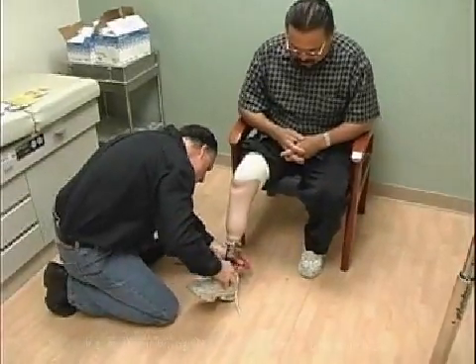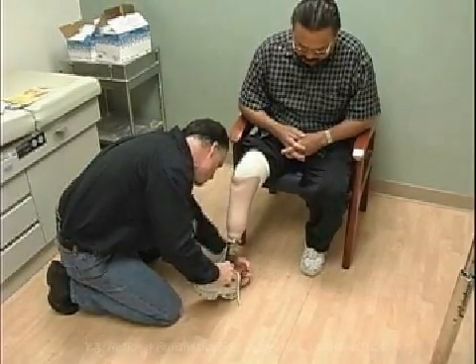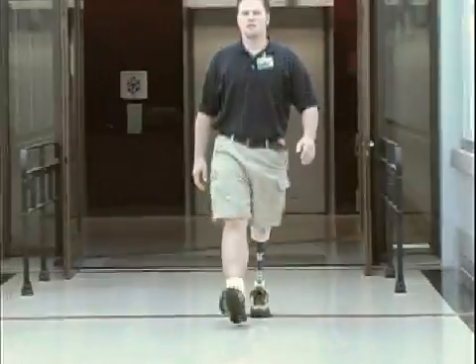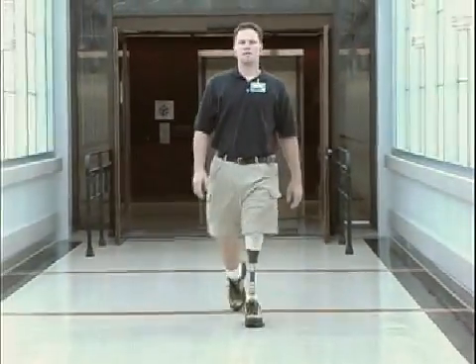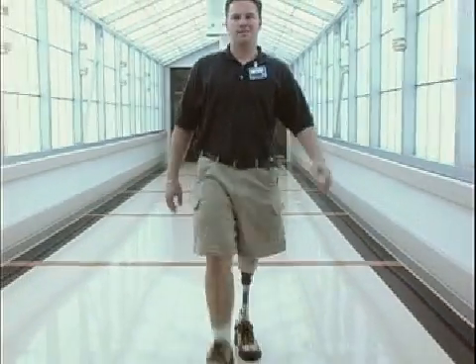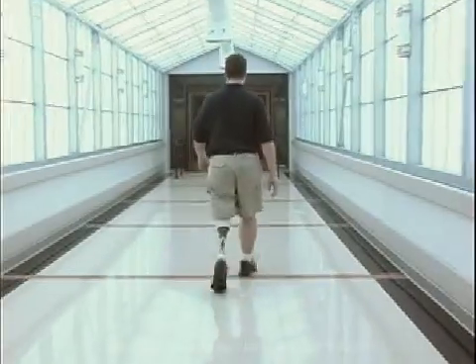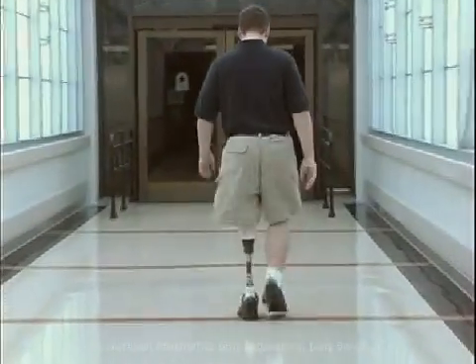The historical conception of a vertical pylon at mid-stance is no longer necessarily valid. If the individual is being aligned or assessed with an adjustable endoskeletal limb, as most persons with an amputation are, the verticality or angular position of the pylon at mid-stance is irrelevant.